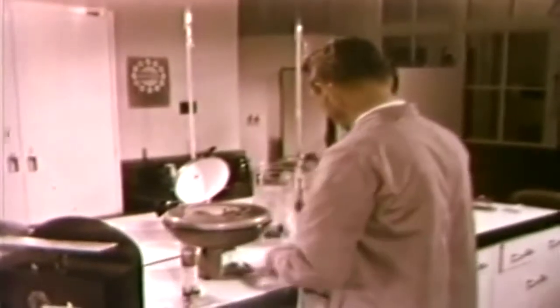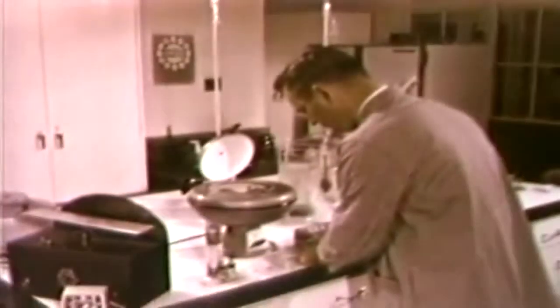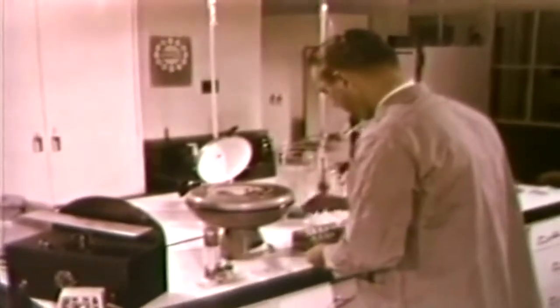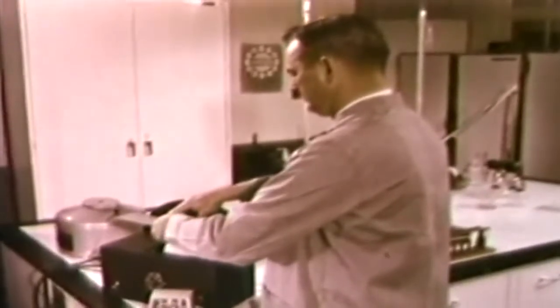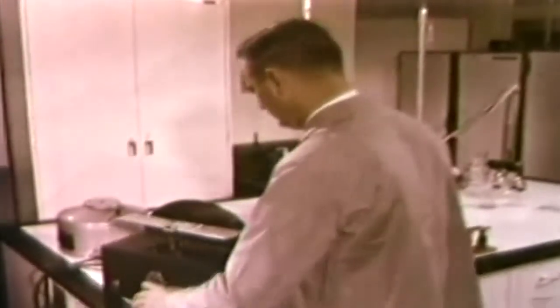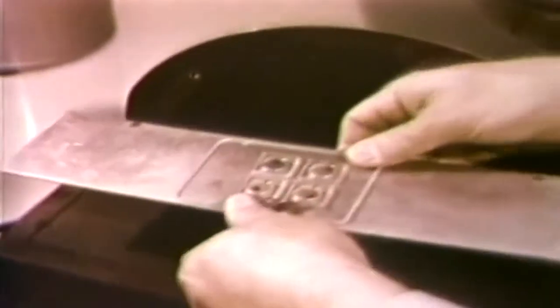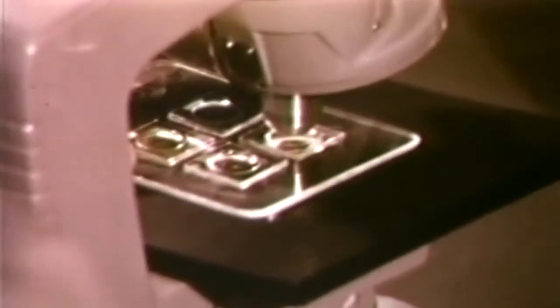To determine the blood group, first a portion of the liquid blood is centrifuged. This separates the heavier blood cells from the lighter serum. After a few minutes in the centrifuge, a liquid blood grouping slide can be prepared. The recessed wells contain both cells and serum, to which testing solutions are added. The slide is then agitated for a short time to expedite the grouping reactions. Now the slide can be read microscopically, and the examiner can determine the blood group of the victim. With this test completed, the next step is to determine origin and grouping of the blood found on the suspect's clothing.